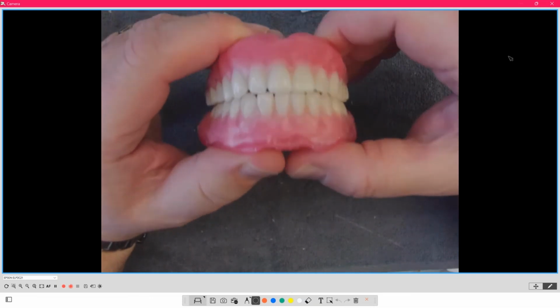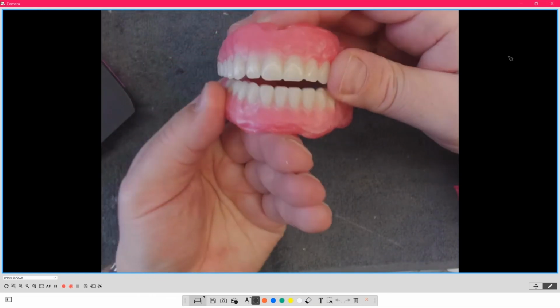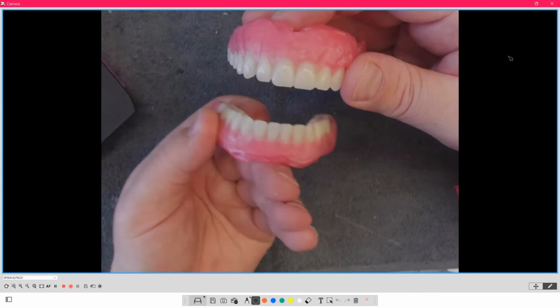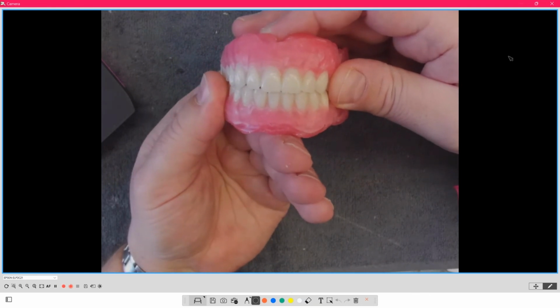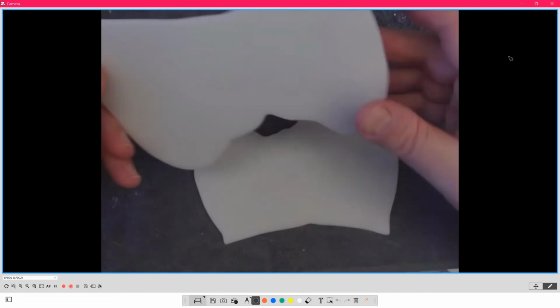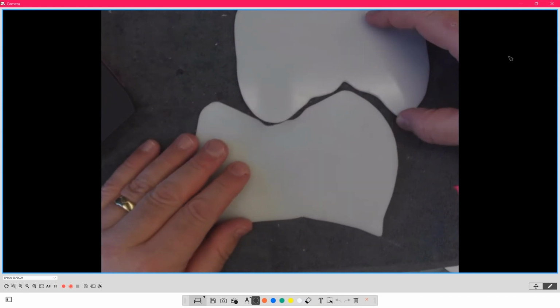So this is the mortar and pestle approach to things. And these teeth are then set within the chew cycle, so that when they're coming in, I'm more worried that the cusps aren't binding when they come through the chew cycle. So this is just the straight. There's that little bit of freedom in centric. This thing can wiggle because now I'm going to bring these teeth into play. So the freedom in centric, and what you saw is that little bit of wiggle here.